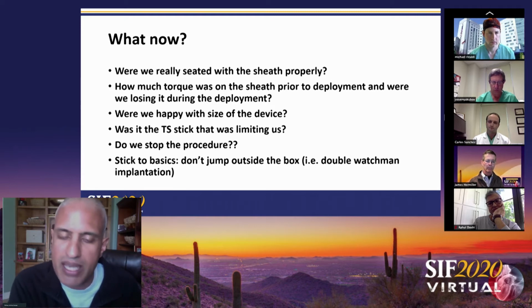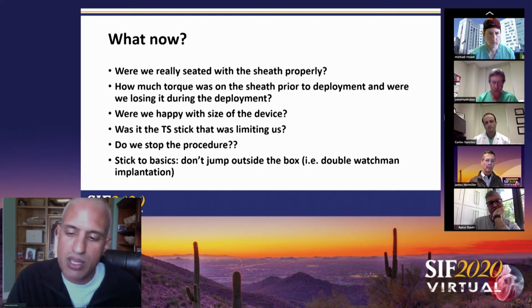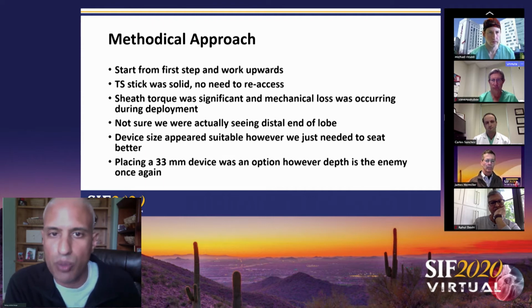This was not one of those cases where I felt this could actually be suitable for that. So I felt at this point in time, we really had to reassess. So what we did is we went through a methodical approach. And I really believe that this has to be the approach of every case, no matter how many you've done. We started back from the first step and worked upwards.